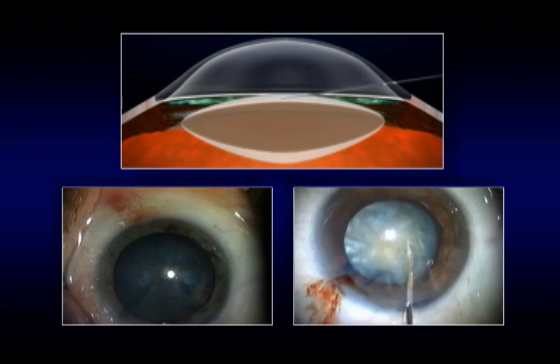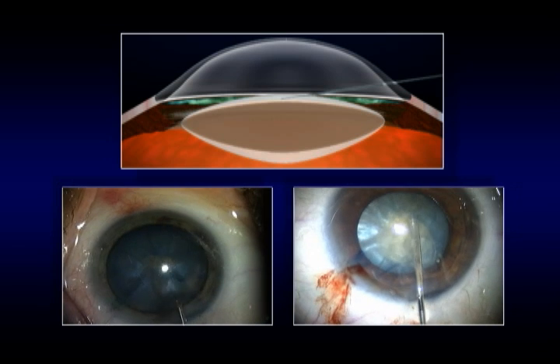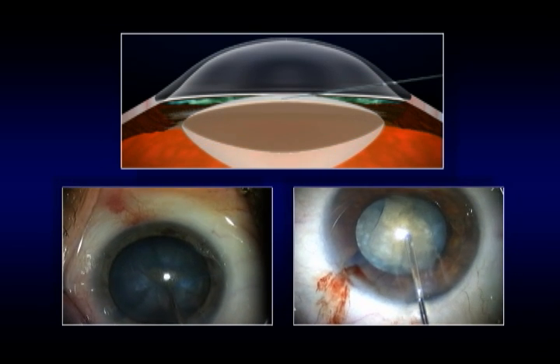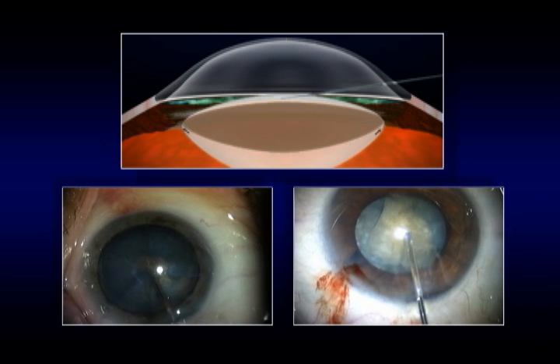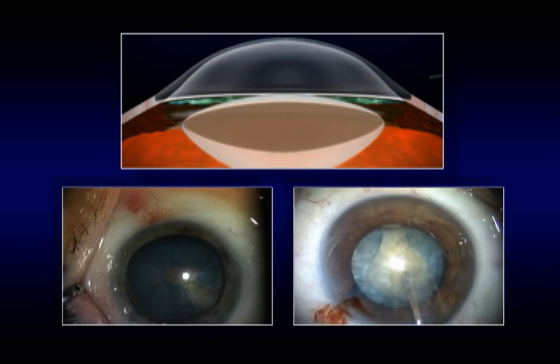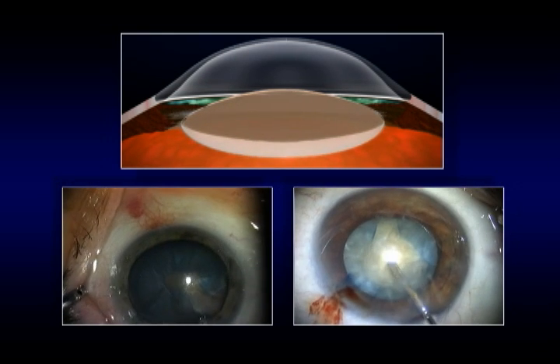These two last cases show us why we shouldn't do hydrodissection in these cataracts. The BSS solution injected under pressure goes backwards. As there is no return flow because of the equatorial block, it causes a posterior pressure increase that is strong enough to rupture the small rexis.